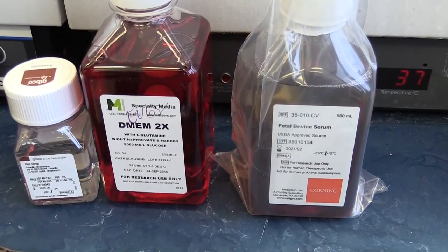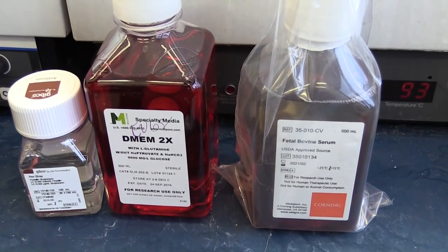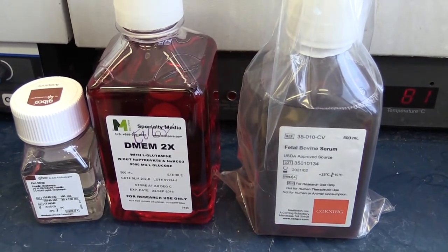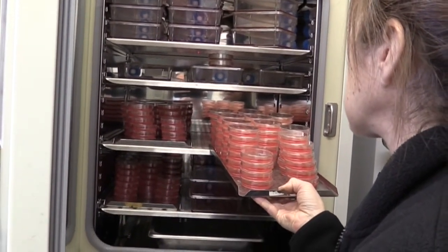Cells are usually grown in a liquid nutrient medium that contains a variety of salts and vitamins, amino acids, glucose, and we also supplement it with animal serum, which contains growth factors for the cells. The red color is due to the presence of a pH indicator. It turns yellow when the medium is acidic and purple when the medium is alkaline.